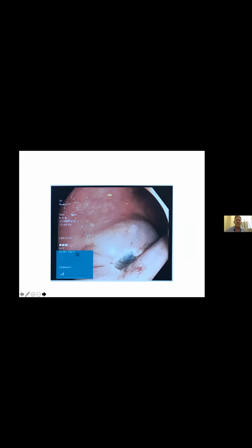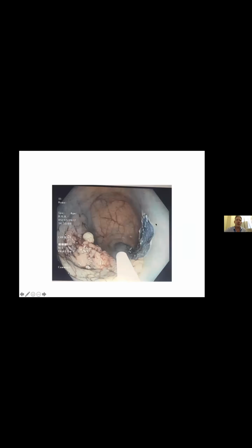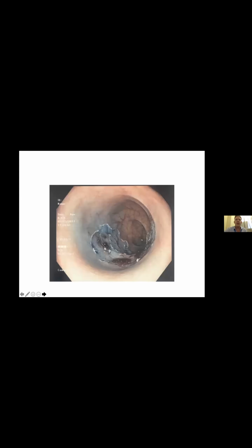And then another patient I'd started over here, almost 50% circumferential lesion that came out, and this is 2.5, 3 hours of work, and left with a colon that looks like that at the end, with no recurrence. So those are obviously more technical, left-sided lesions, but quite satisfying, much better than having a left hemicolectomy if you can avoid it.